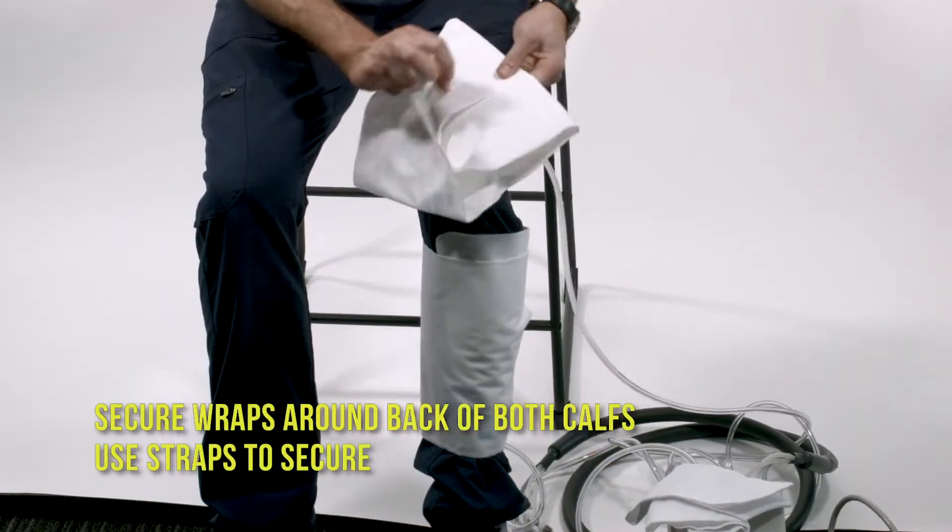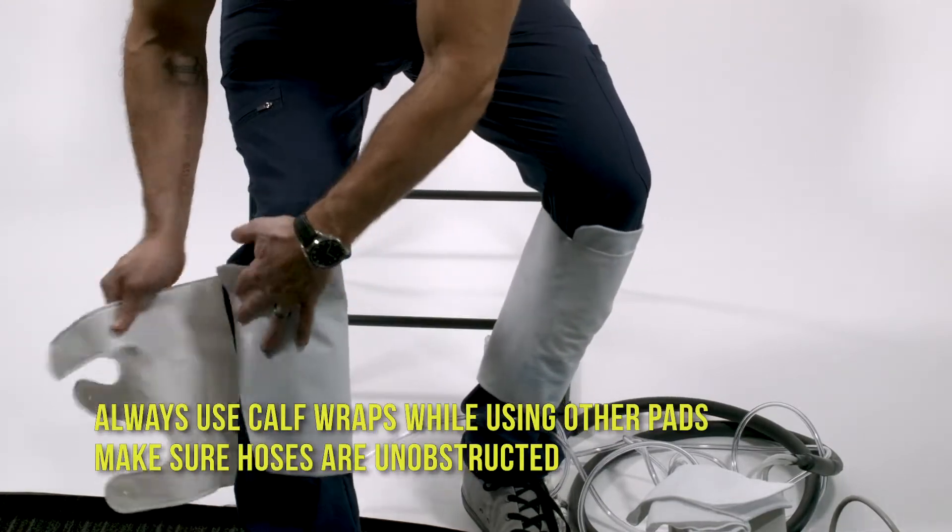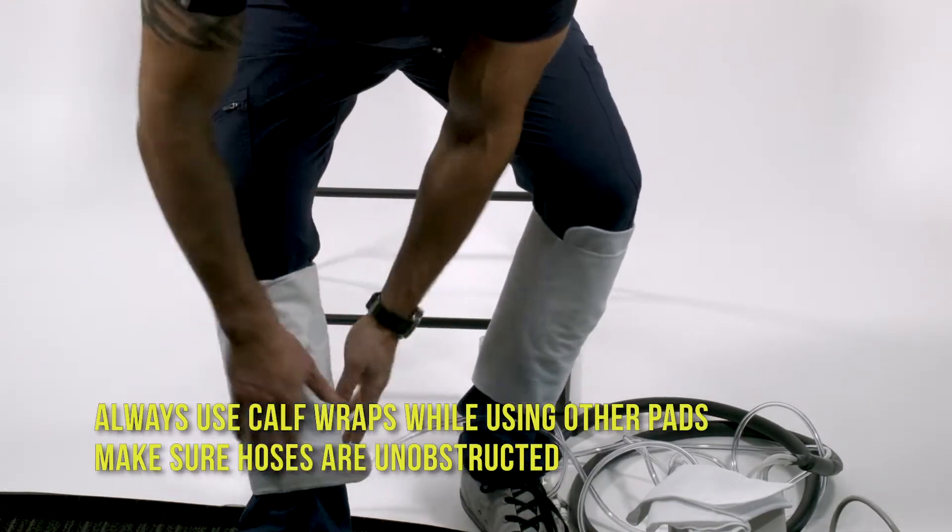Secure the wraps around the back of both calves and use the straps to secure. Always use the calf wraps while using the other pads. Make sure the hoses are unobstructed.